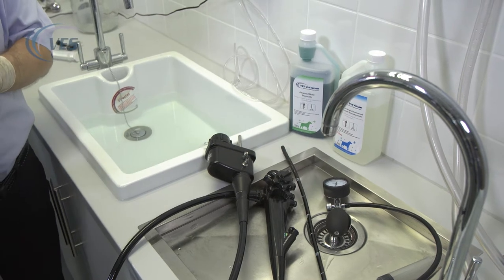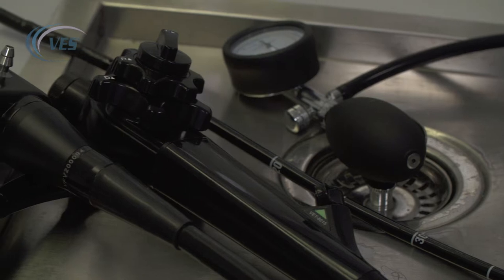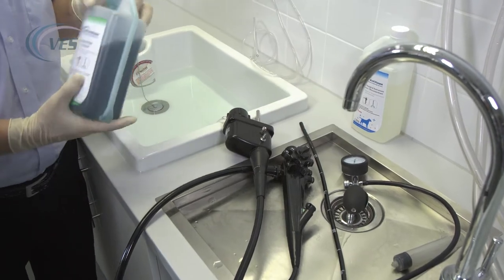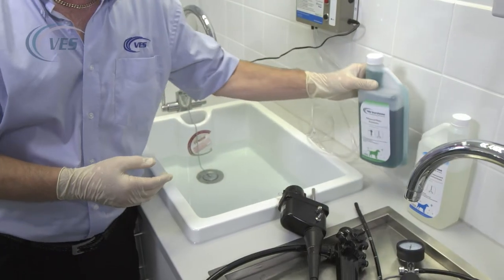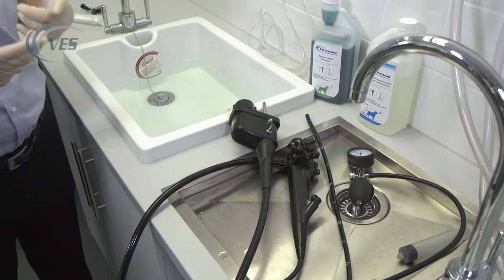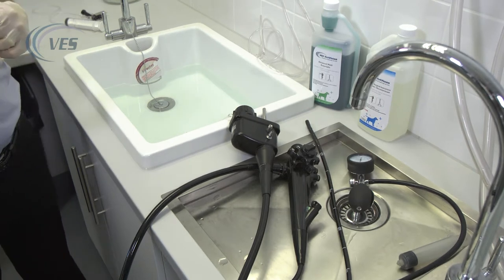In order to preserve the life of the scope, it is imperative that a cleaning procedure is taken as soon as possible after the procedure. We recommend that you use enzymatic, which gets rid of the pathology inside of the scope. It's quite aggressive, so please always make sure that you use gloves when you're handling this chemistry. Follow the manufacturer's guidelines in terms of dilution and the length of time that it has to be soaked into the chemistry.